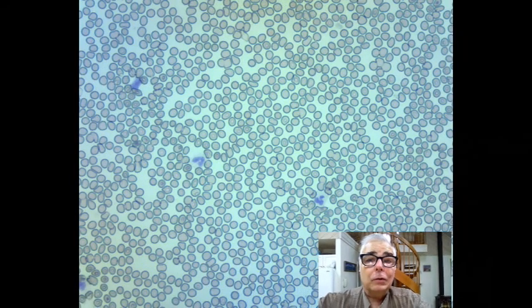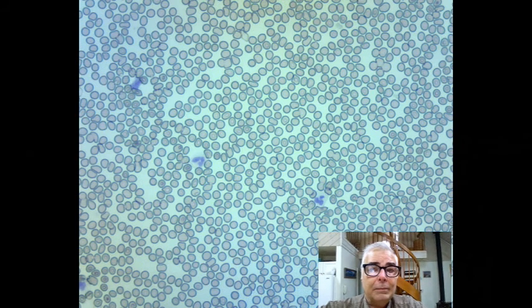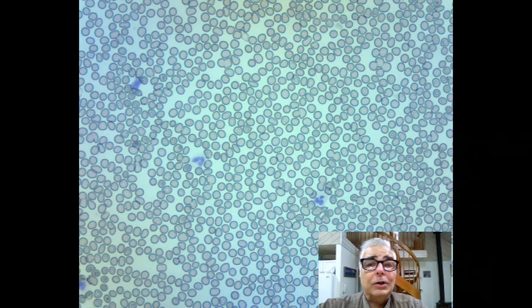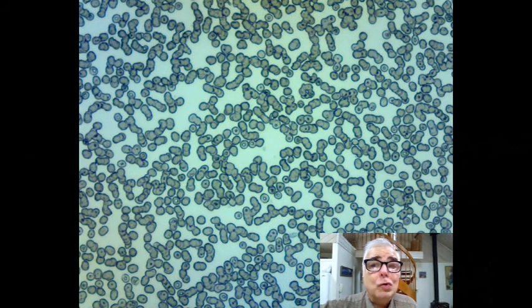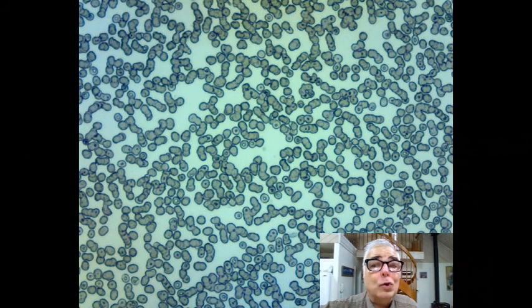This is what the monolayer looks like in a good area where the cells are almost touching each other and there may be one or two overlaps but there aren't many. Most of the cells you see are red blood cells. In this field of view, there are a number of white cells which are the ones that have the bluish stained nuclear material. Here's a spot where there are too many red blood cells — you notice they're overlapping and piled up a little bit. That is an area you don't want to count.